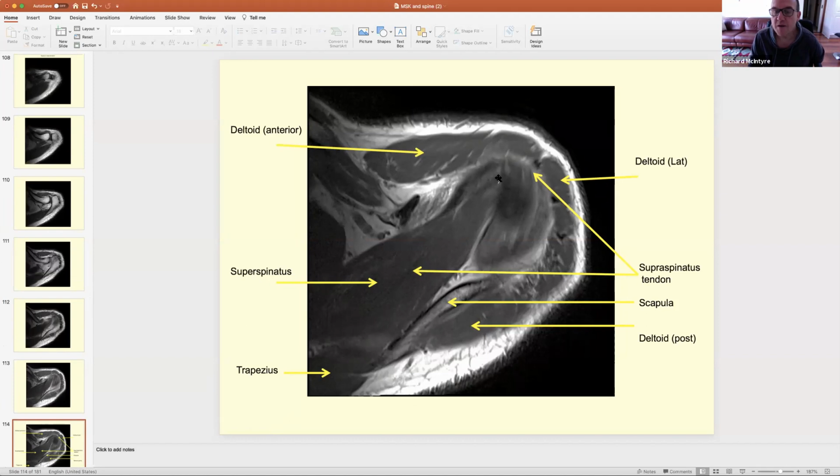That's important for us because all these images that you'll see, the coronal and sagittal images, are all perpendicular or orthogonal to that muscle. Okay, so you won't get images that go across this, that are orthogonal to the patient. They're all going to go along that muscle, and you learn that technique in third year and fourth year.